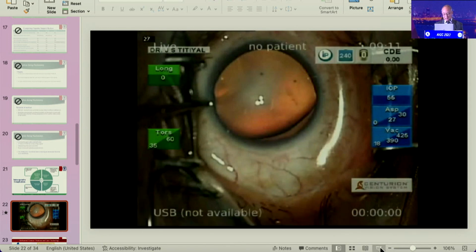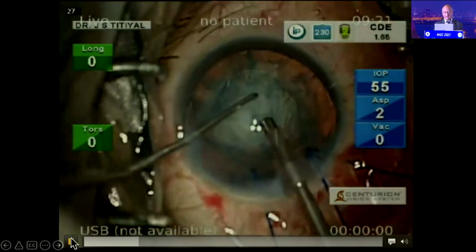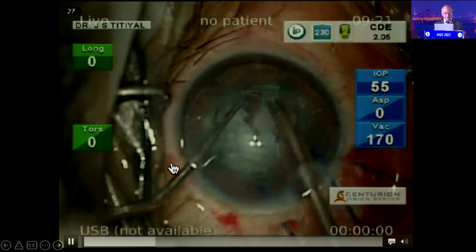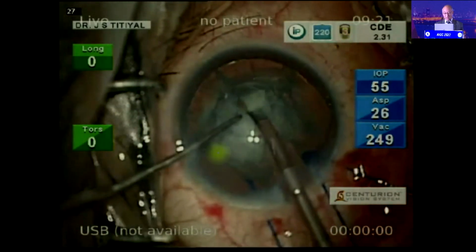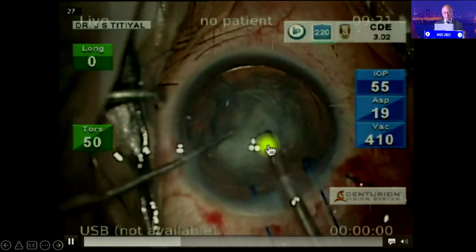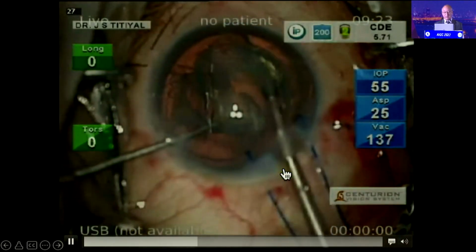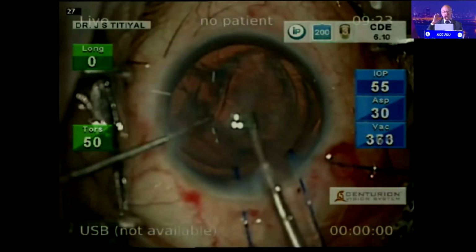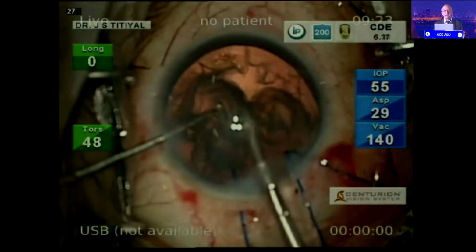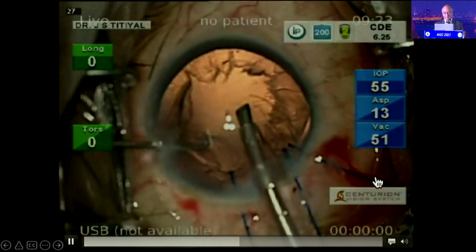Nucleus can be managed effectively in these cases. You can see here, this is the chop I'm initiating. If you see carefully, the rotation is difficult in this area. So once you see this happening, take out this piece, the nucleus will now tumble into the central area and rotation can be avoided. If you avoid the rotation, the stress to the zonular complex is less and you can maintain the integrity of the remaining zonules in the right manner and subsequently complete the surgery in these cases.